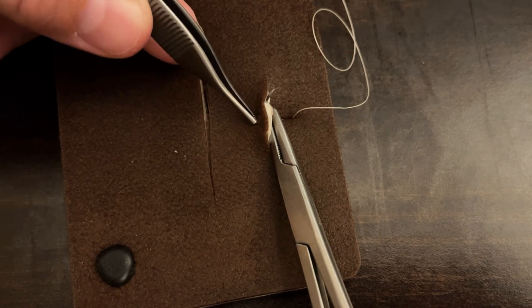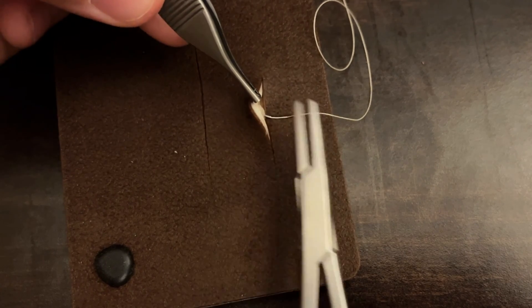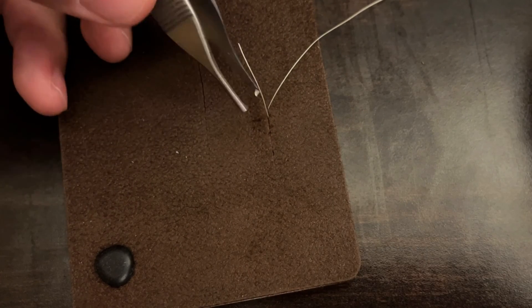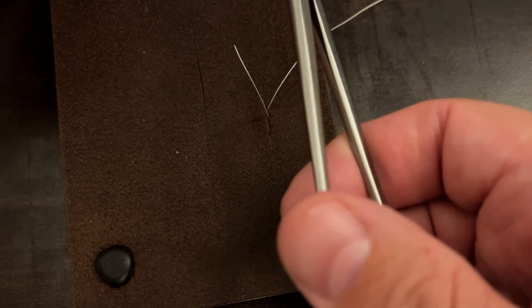You want to make sure that you didn't exit out on the surface by accident and create what we call a buttonhole. I'm going to release and then pull that the rest of the way through, then pull my tail a little bit so it's not too long to pull through later.